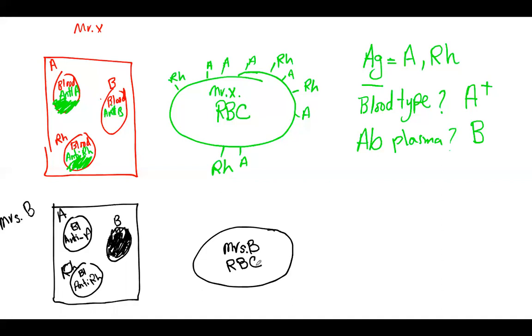Now, the anti-serum that I had for the blood sample did not identify any antigen. Therefore, anti-A did not identify antigen A. No antigen. Same thing is true for the anti-RH antibody. Didn't recognize anything, no clumping. But you did see B clumping, which means antibody B recognized antigen B. So I'm going to draw my antigen B right here.